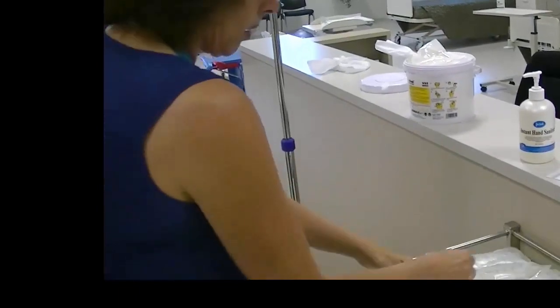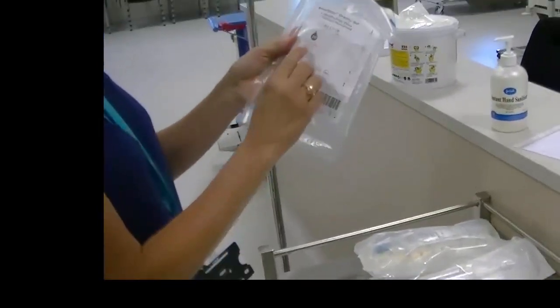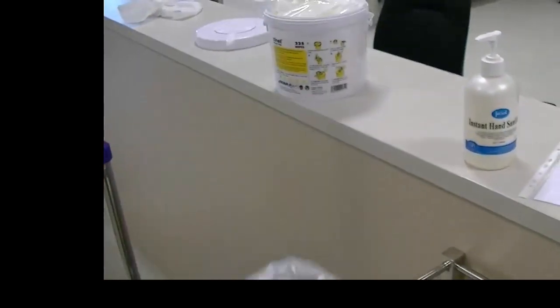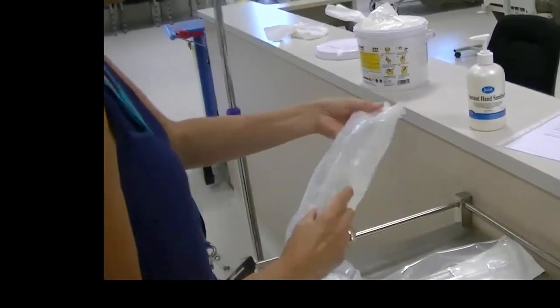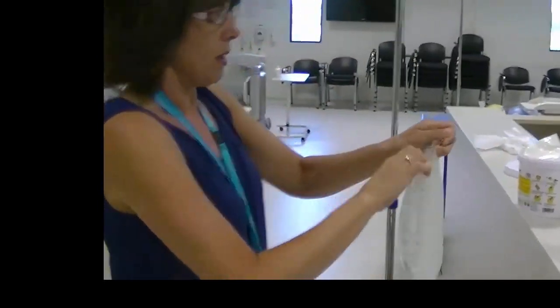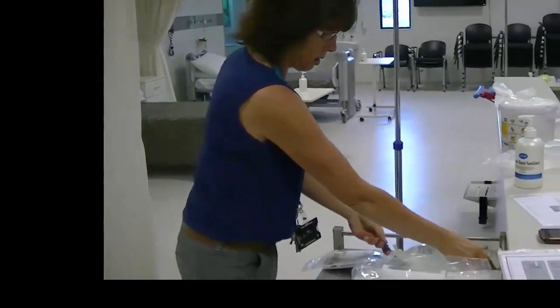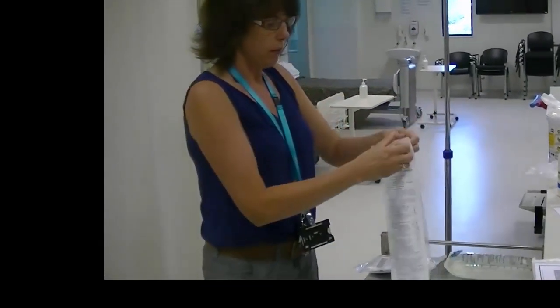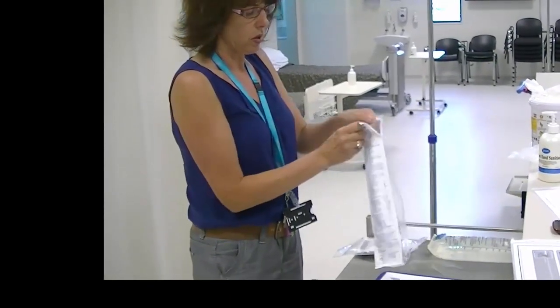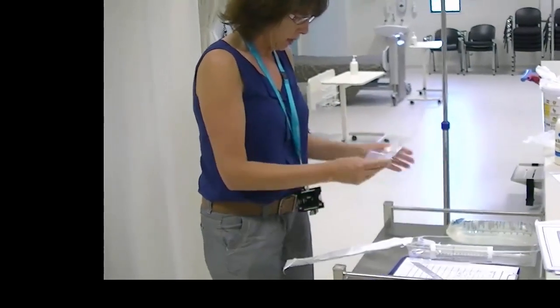Okay, got my burette and my line, which is just a gravity line. This line is a 20 drops per mil giving set, so I'll use that in my calculation. Okay, so I washed my hands previously. I'll rip my bag open, and when I open up the line and the burette, I'm not just going to toss it onto the trolley. I'll leave it sitting there in its sterile package.